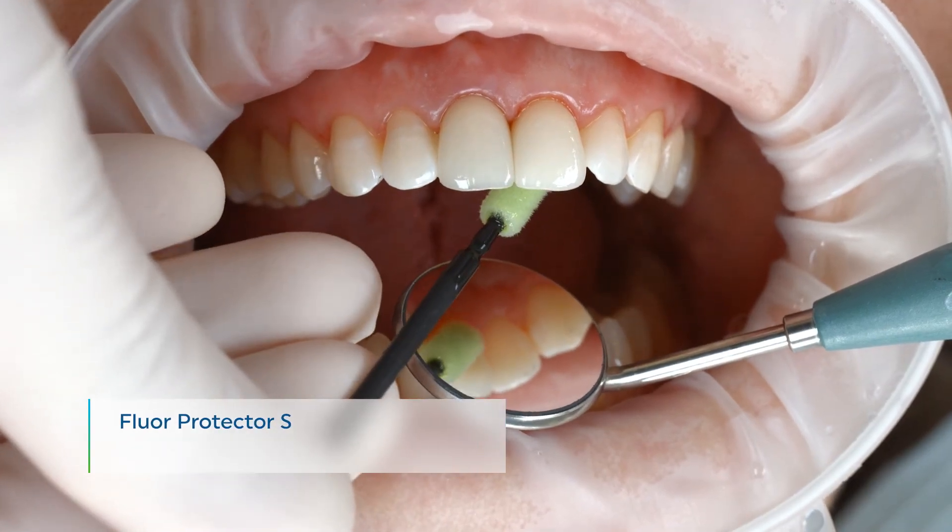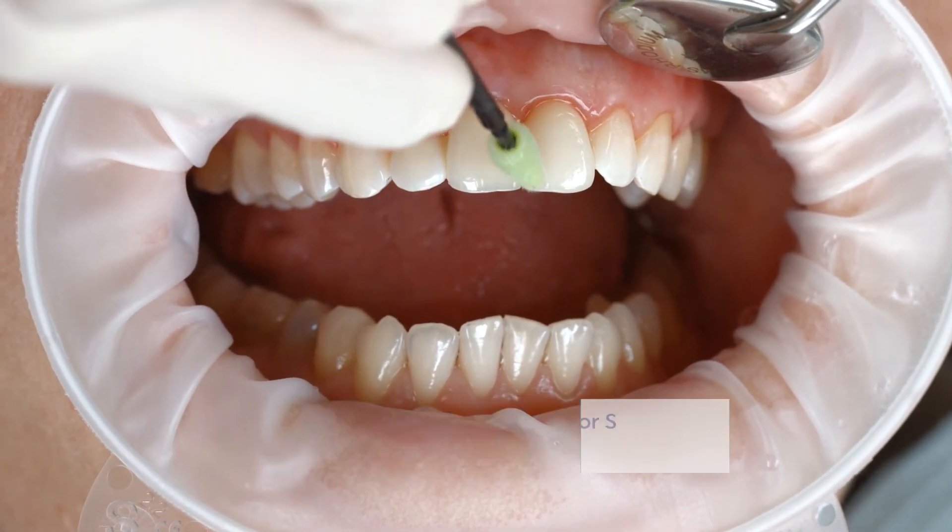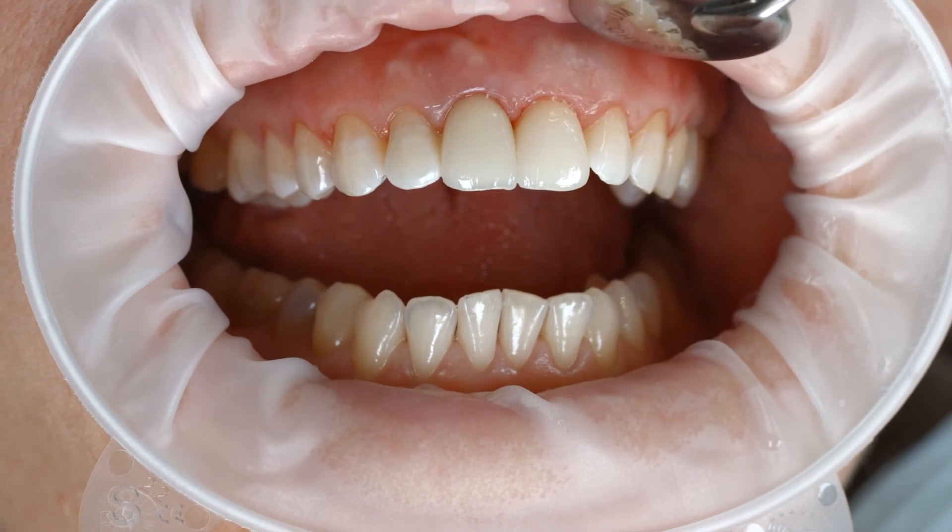Polish the restoration margins with polishers such as Astropol or with discs. As a final step, apply a thin layer of Fluor Protector S with a Viva brush or a conventional brush. Use the air syringe to disperse and dry the varnish.